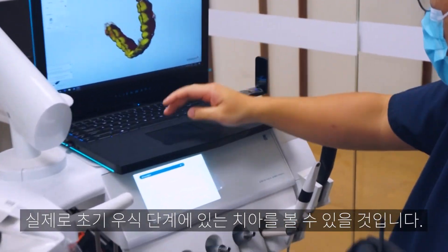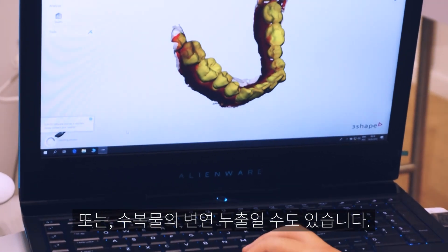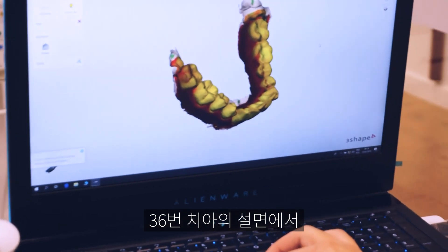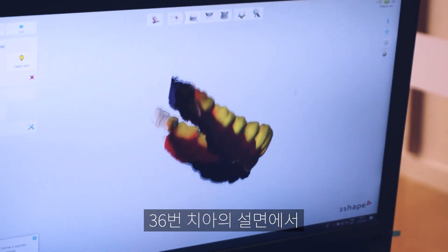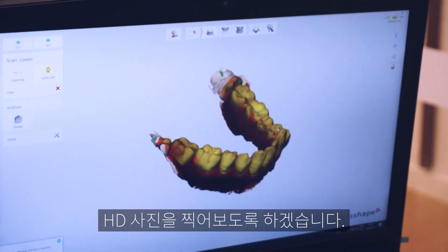Looking at this area, we may have actually found a little bit of early decay or leakage of a restoration — just see on the lingual of that 36. We're going to try and take an HD photo of that, where potentially there may be some problems.